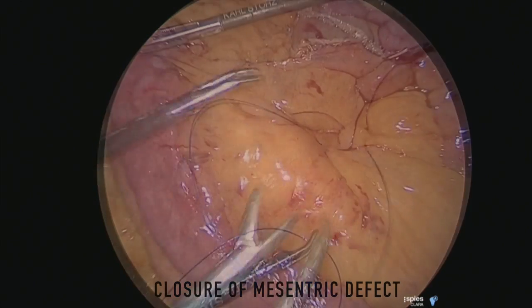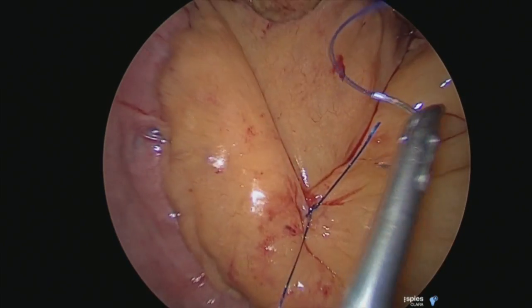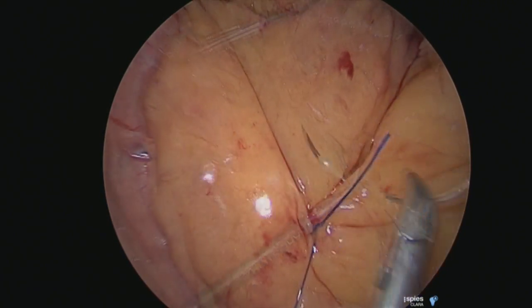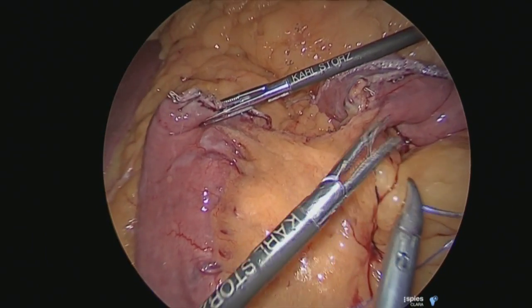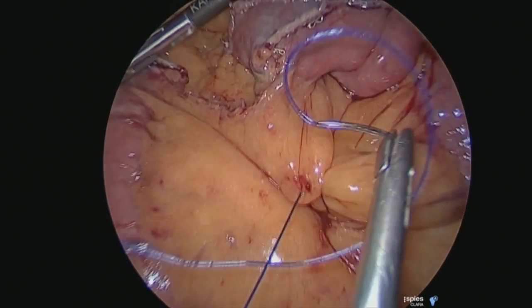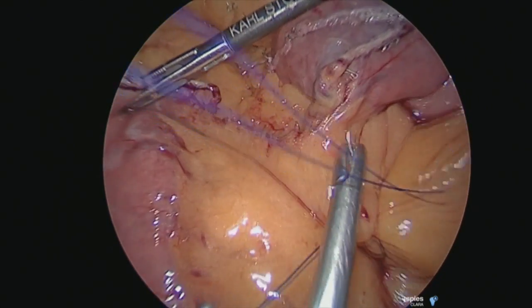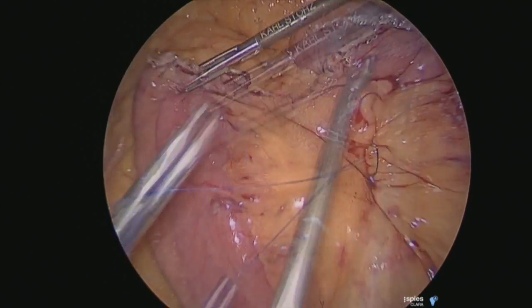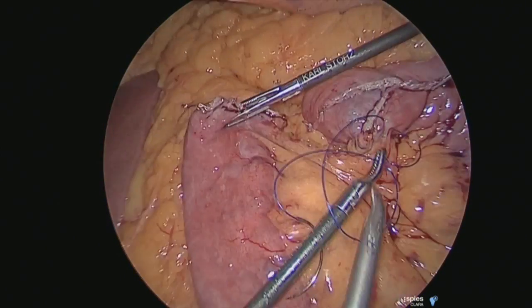The next step is to close the mesenteric defect. You always use a non-absorbable suture and preferably a monofilament suture. You never close it interrupted — you always close it in a continuous fashion to make sure that the small gaps in the mesentery are completely sutured and closed. I usually use Prolene 2-0 and end it with a Prolene suture to prevent kinking.